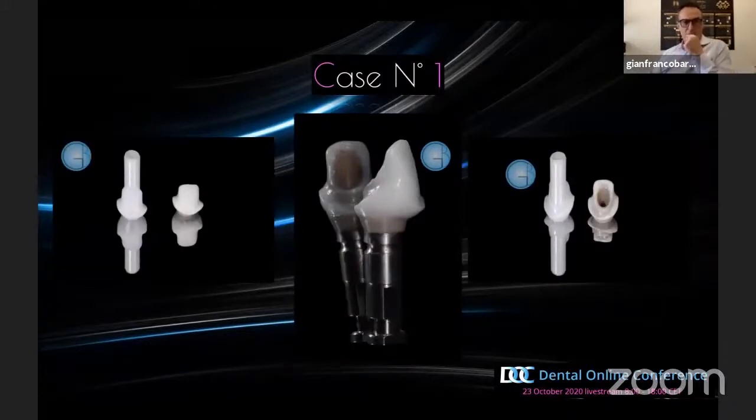The abutment was zirconia. What is really important is the design of the contour of the abutment.